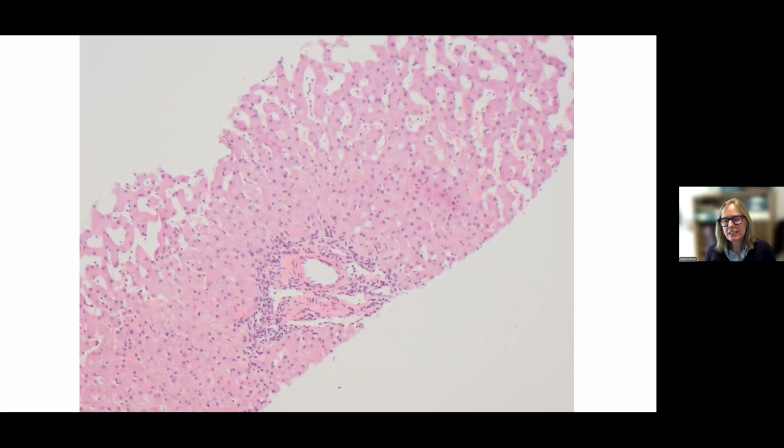And then another of these structures. So this one, it's got ductules around the periphery. It's got really quite a large artery here. There's another arterial profile there. And although there is a biliary structure here, it isn't quite right to be a duct proper. It certainly isn't of the similar caliber to that arterial profile there. So ask yourself, is that a true portal tract or not?